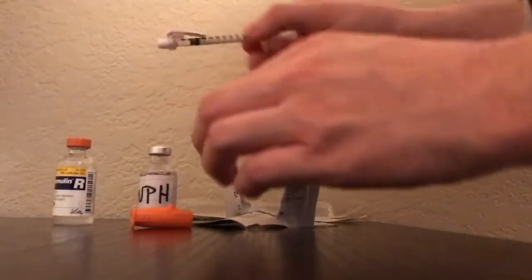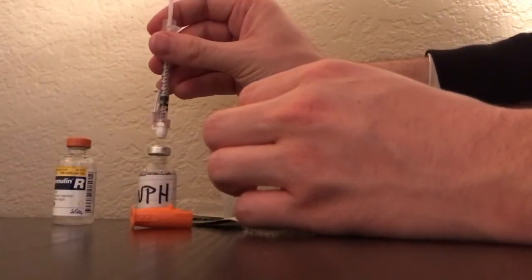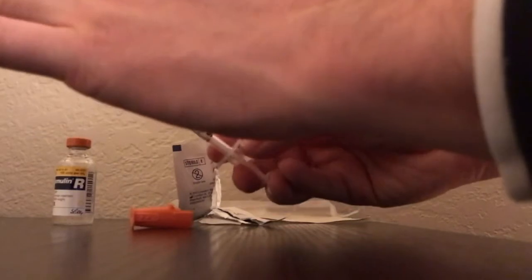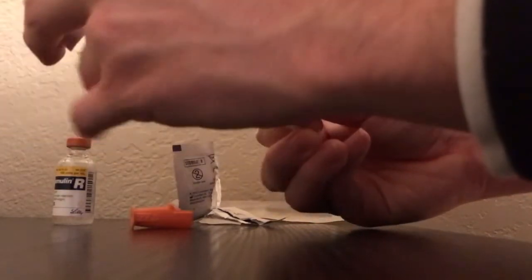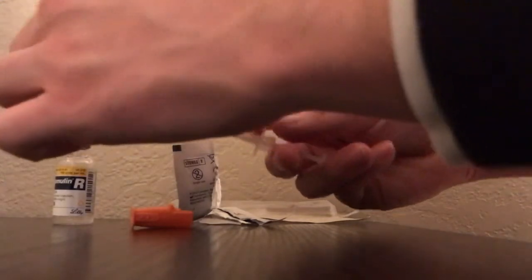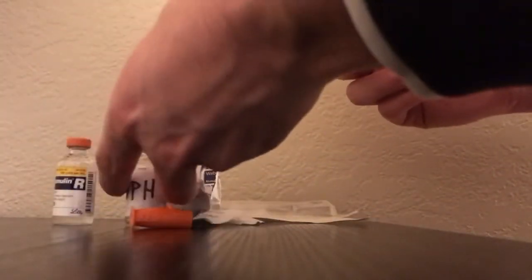Grab your NPH cloudy solution, place it in there, and withdraw 10 units. After you've got both solutions mixed in there, verify with another nurse to make sure everything is up to par—same order, same dose. Label your syringe and take it to the patient's room.